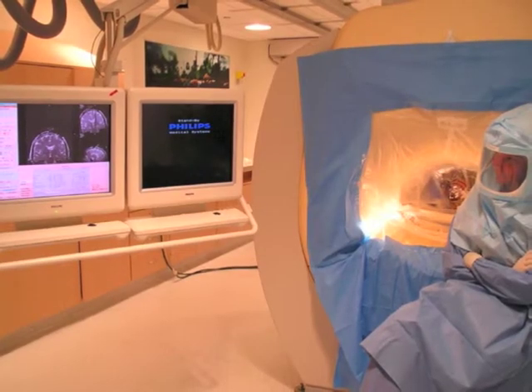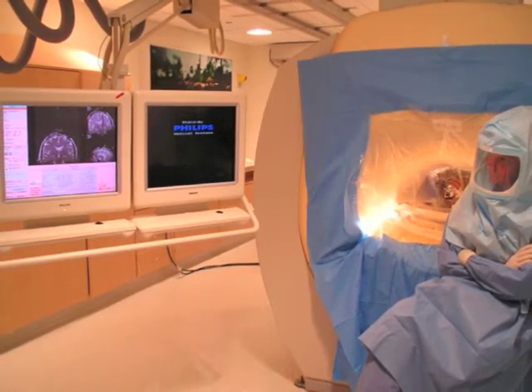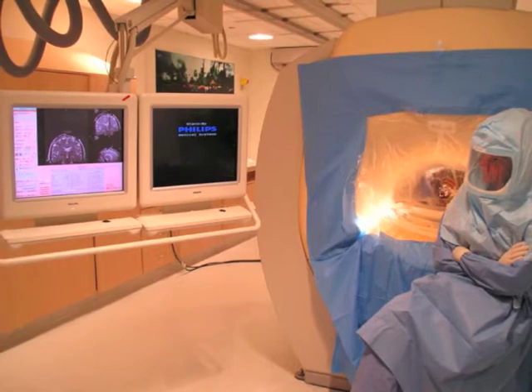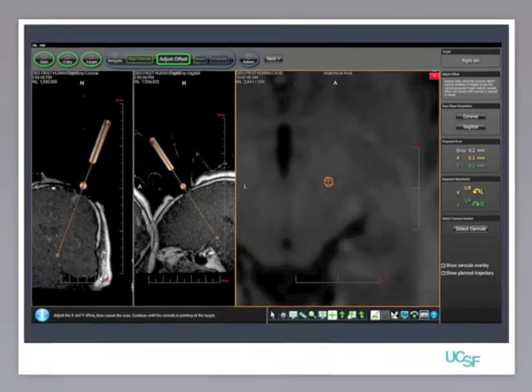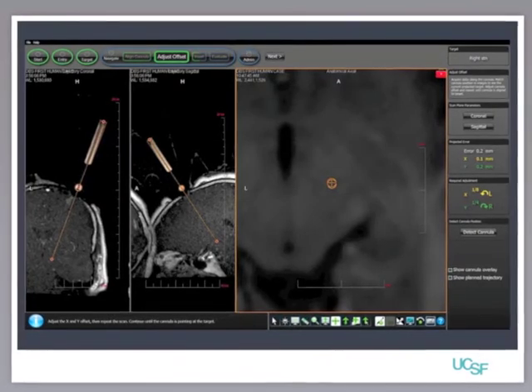And this is an MRI scanner on the 3rd floor of our hospital that is draped out in a sterile manner so we can actually do these operations with a patient asleep and get MRI images during the operation to guide the electrode placement. And so again, we can get multiple MRI images, and we can use the imaging instead of the brain activity to guide the electrode placement. And so in this technique, the patient doesn't have to be awake for their operation. Of course, the patient misses out on a lot of fun if they're not awake for their operation. So there are 2 different ways to go about having this done, and we do both of them at UCSF.